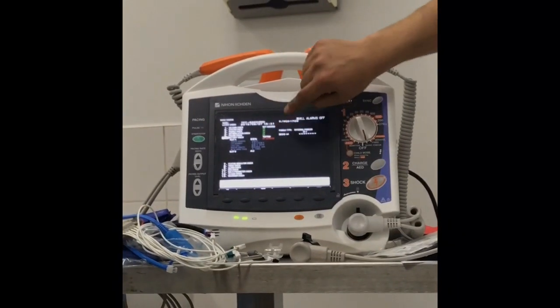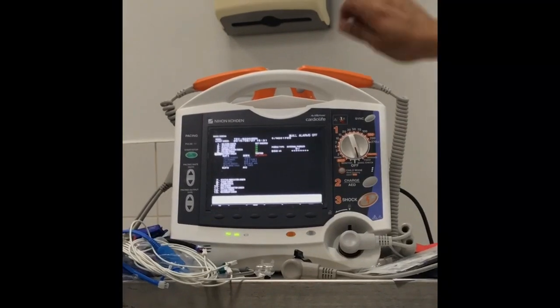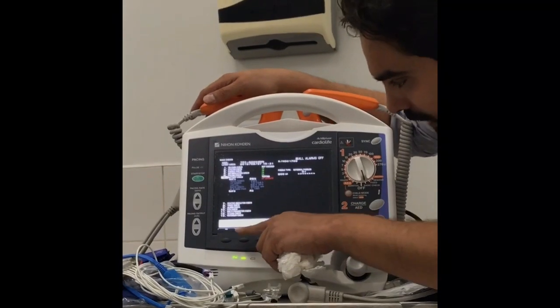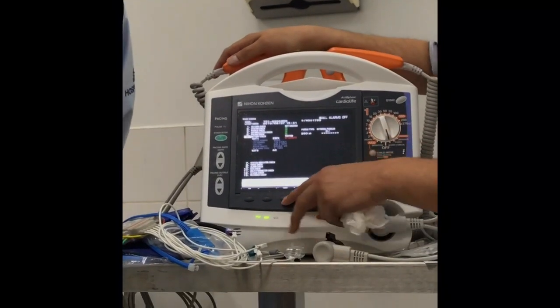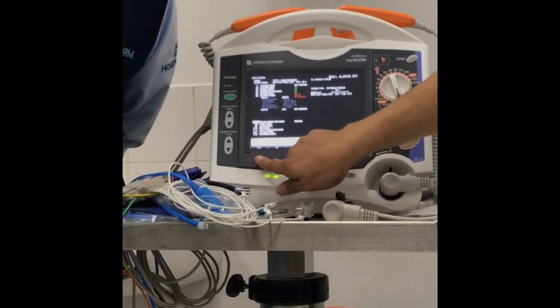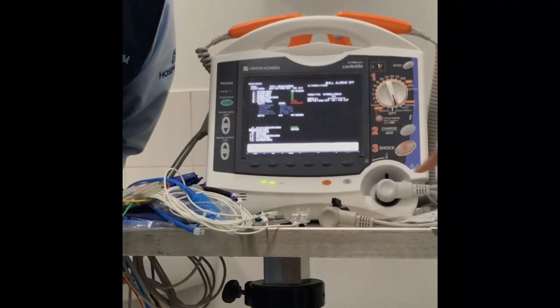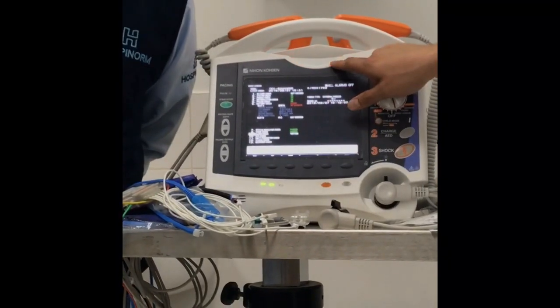Now, is this one indicator red? Yes. Is this one green? Yes. Testing voice instructions. Yes. Is this one critical? Okay, this is the critical indicator, or a crisis. This is orange, advisory. This is blue. Blue means sensor out, ECG electrode out. Blue means technical. Yes.